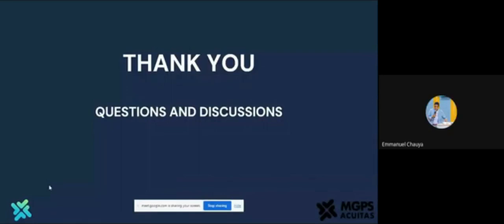Thank you for the wonderful presentation. My question is, I've noted that in the explanation there was a statement implying that you're using an oil compressor, and I was wondering, is it not possible to use an oil-free compressor, considering that the waste we generate by using the oil compressor, we also have to remove in the second stage?